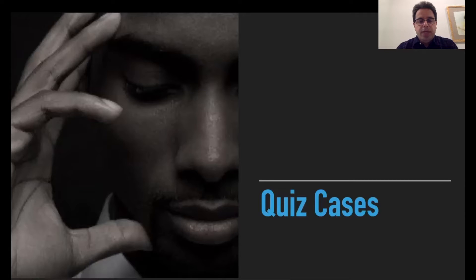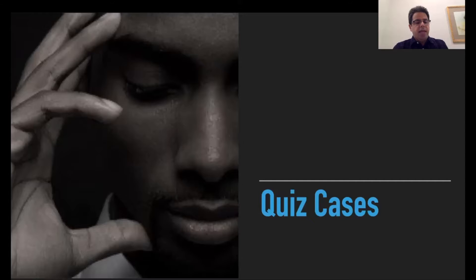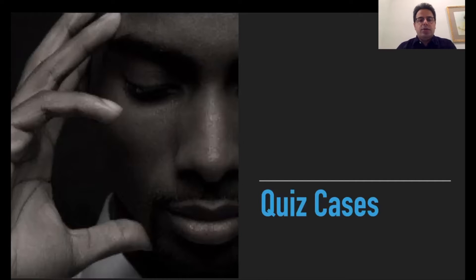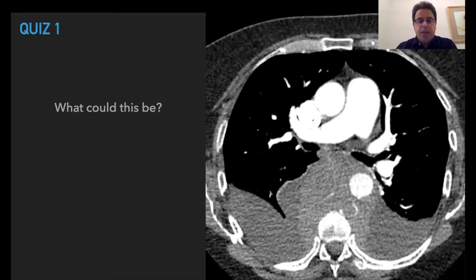Let's look at some cases. I don't expect a definite answer, but try to make some differentials for these cases. Case number one: what do you see here and what is the best differential for this?